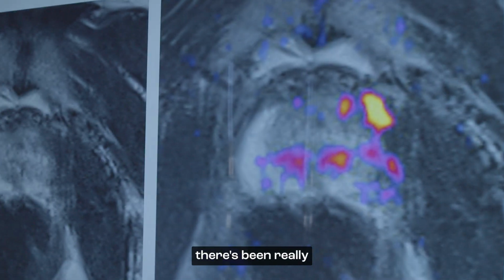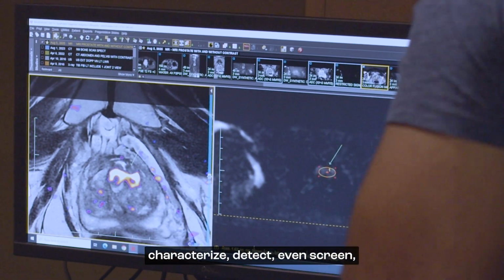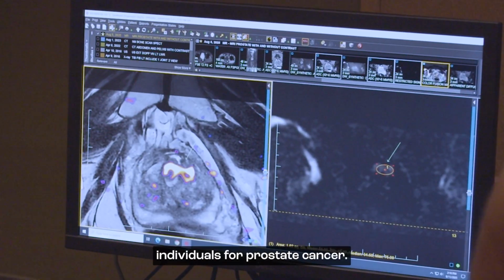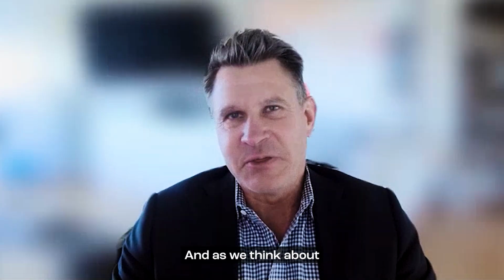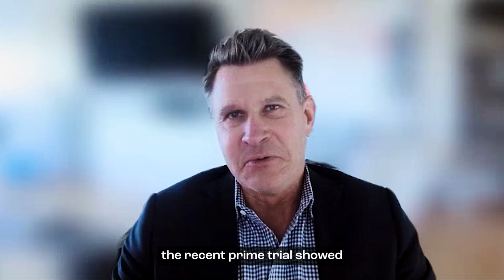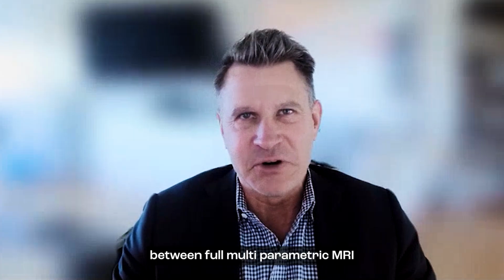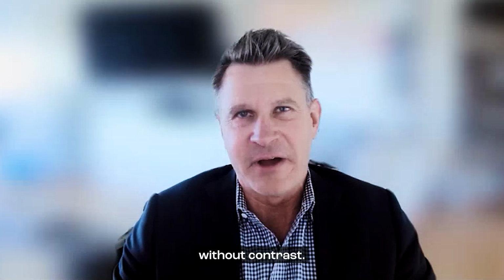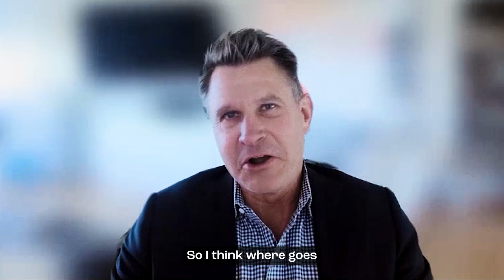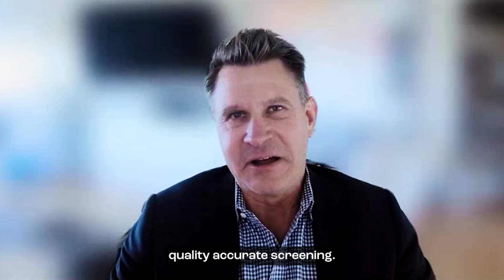Over the last 10 years, there's been a massive growth in using imaging to characterize, detect, even screen, increasingly in asymptomatic, healthy individuals, for prostate cancer. As we think about cancer screening in general, and especially prostate cancer screening, the recent PRIME trial showed rough equivalence between full multiparametric MR and biparametric MR without contrast. A big part of that is diffusion-weighted imaging. So I think where goes diffusion-weighted imaging goes high-quality, accurate screening.